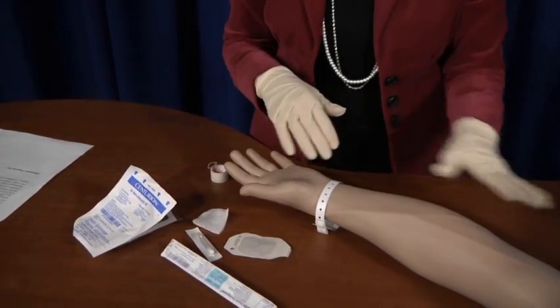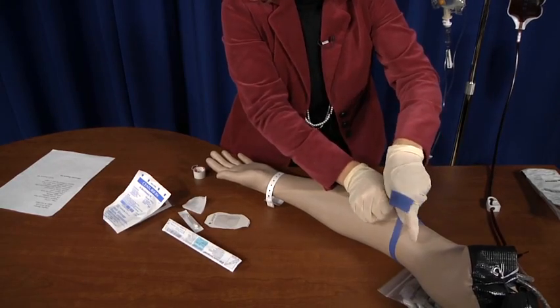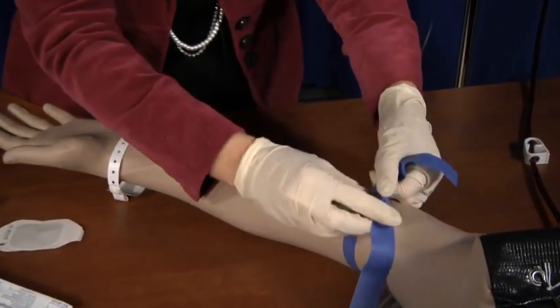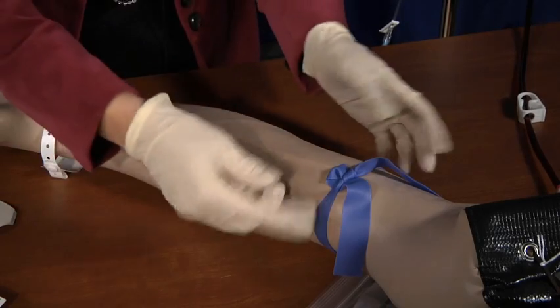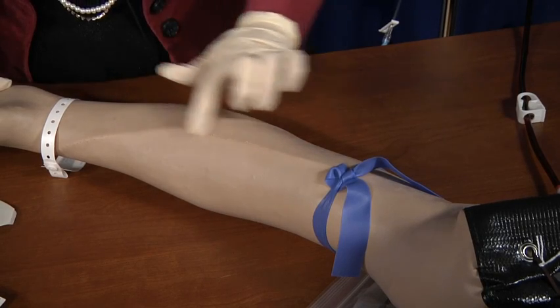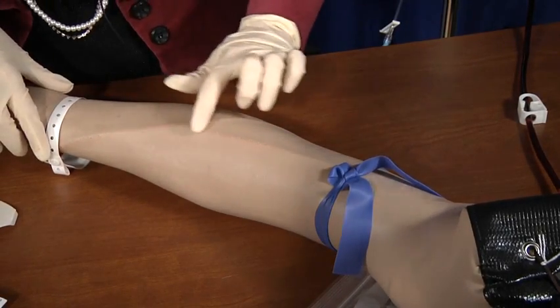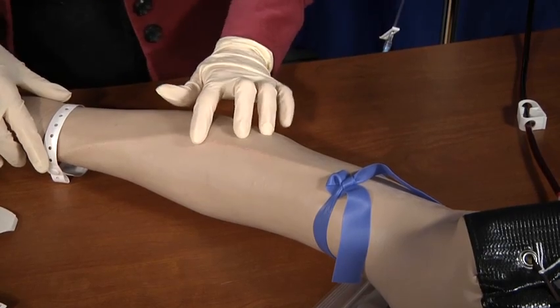All right, so what we need to do first is put the tourniquet back on. Now, I like to do the X tuck. That's what it's called. It's a slip knot. So you X, hold it, and tuck it in. You don't want to make a knot because you can't take it out very easily. So we do the X and the tuck. We're going to come up close to the elbow, but we're not going to go into the elbow because every time they bend their arm, the solution will then stop. So we're going to come up a little bit higher than this, but not quite to the elbow. So we're going to initiate in this area.